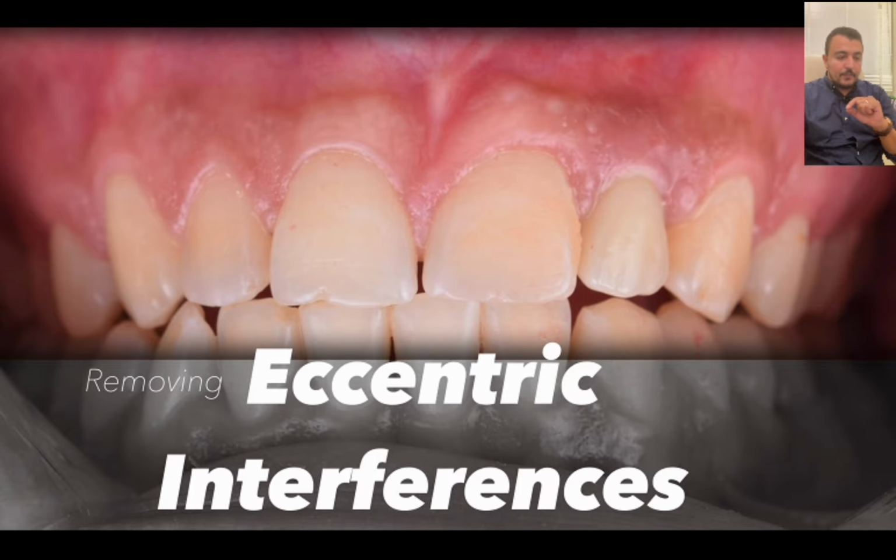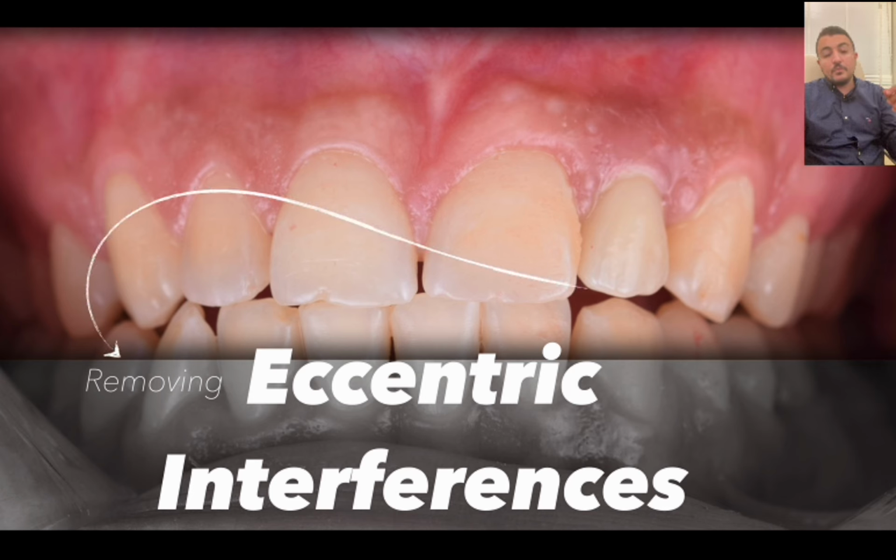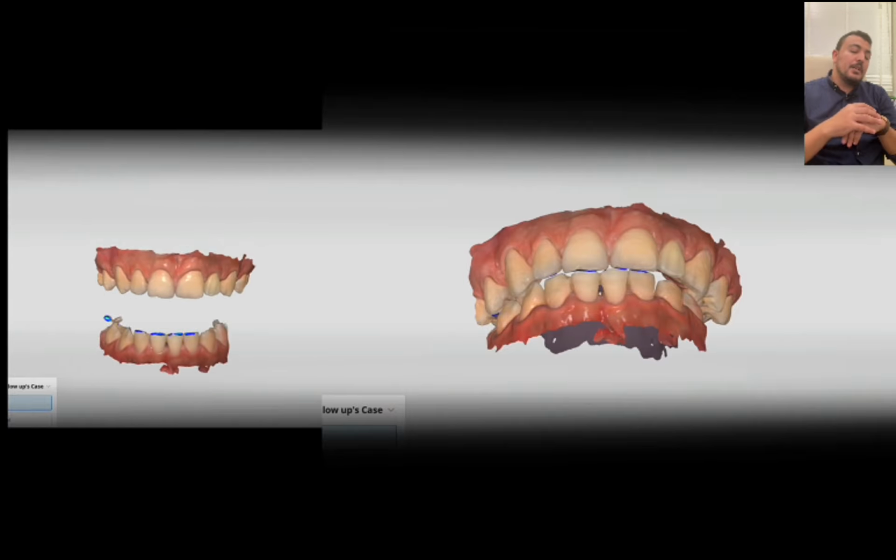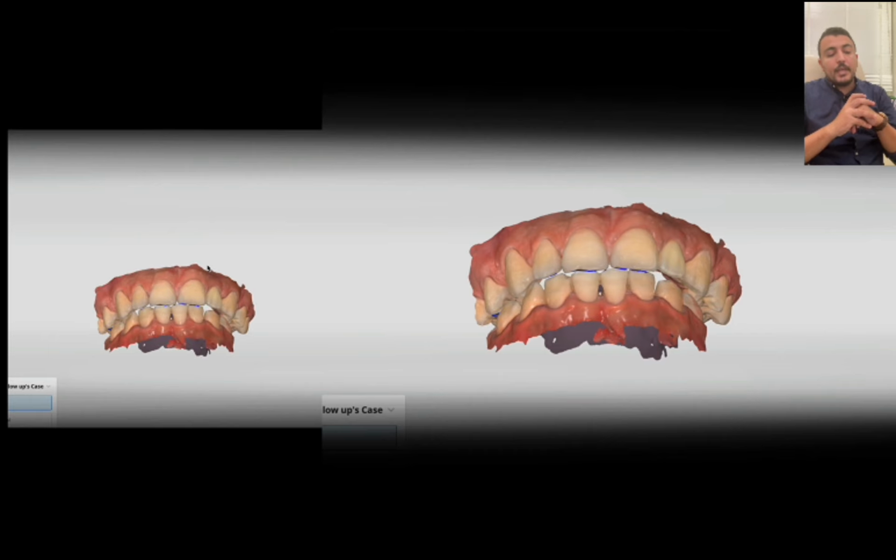which is occlusal analysis. Also, for the eccentric contact, we have to remove any eccentric interferences in the protrusive movement according to the patient movement. So for this implant crown of this lateral, we have to remove any eccentric interferences, and this can also be confirmed with the jaw motion software, so we can make the patient protrude to the protrusive position.